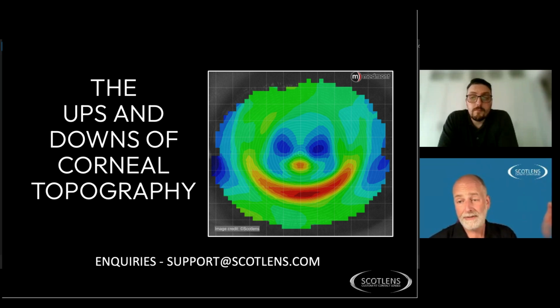At that point, you've got to fit 100 patients to find 10 that are actually going to be happy with the quality of vision. And hyperopes is very much the same thing. So from a commercial perspective, no, it doesn't work. Some of the lens manufacturers say they do a plus power, but it's usually up to about a +2. From an optical perspective, it just smears your vision. But low hyperopes that are presbyopic will do anything you want. Still, I would rather sell them a good pair of varifocal specs that they're happy with and that give them really great performance. It's not like they're struggling for contact lenses from a lifestyle perspective.